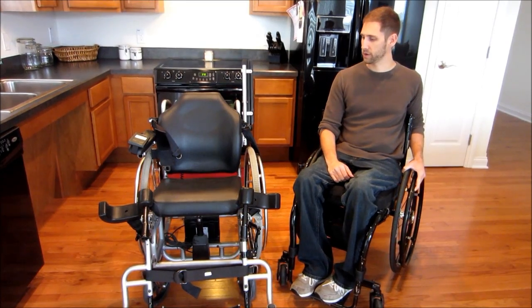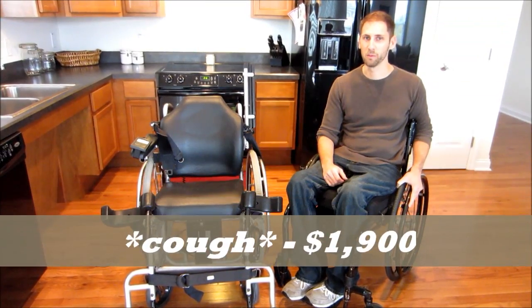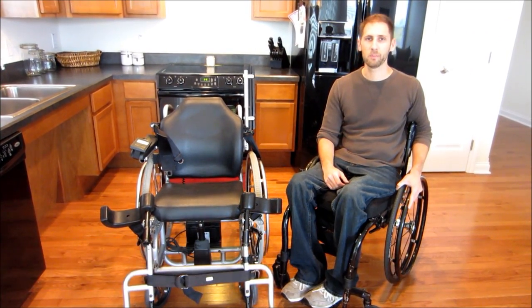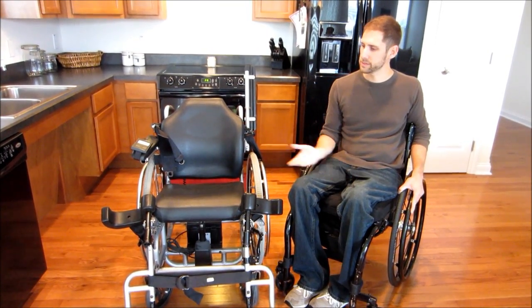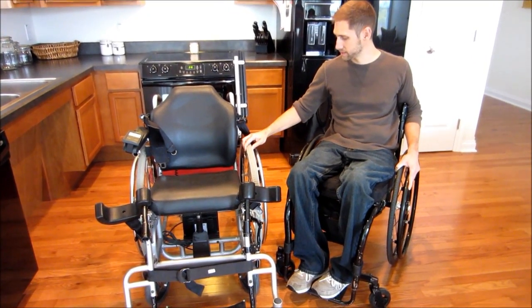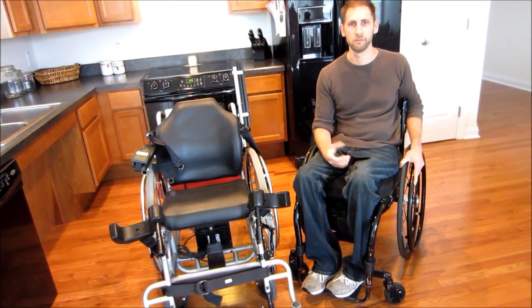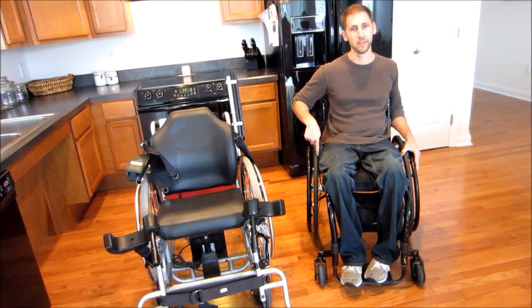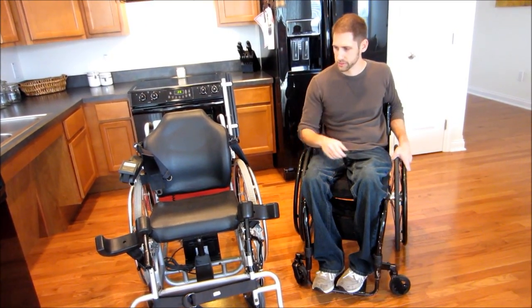A guy was selling it on Craigslist, and I ended up paying a lot more than I think it was probably worth. This thing's probably about 10 years old. It's battery operated. It's got a power lift that you use these two buttons to lift it up and set it down. I had to replace the tires because they were so old that they were just falling apart. So I put my original wheels that used to be on this chair, and had to replace the front casters and stuff like that.